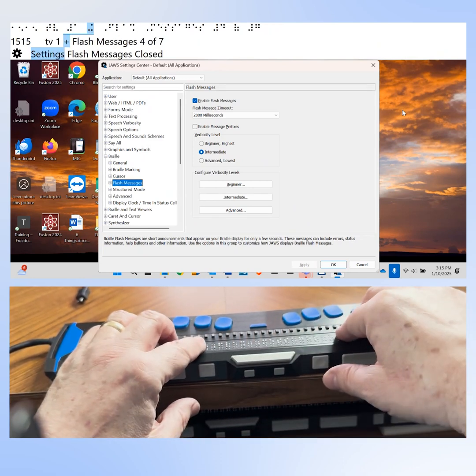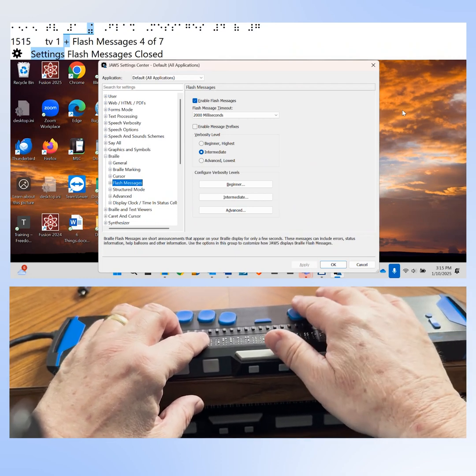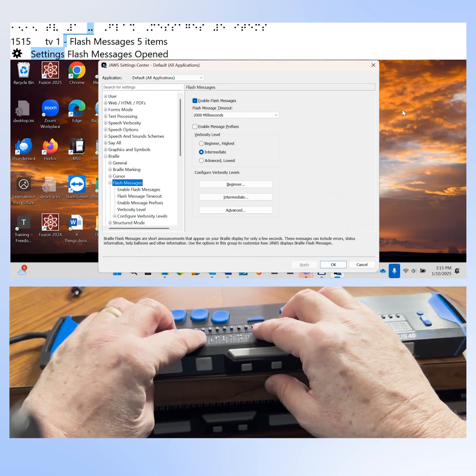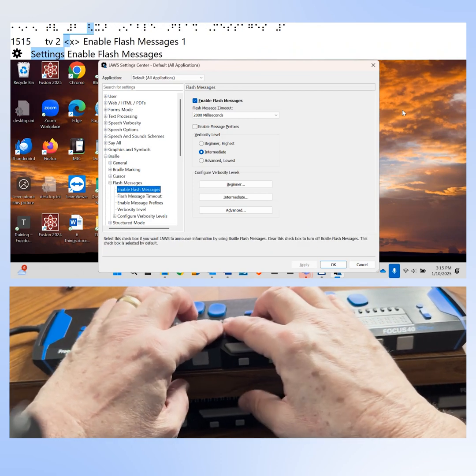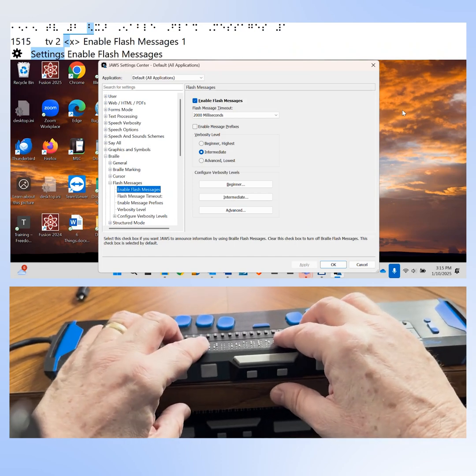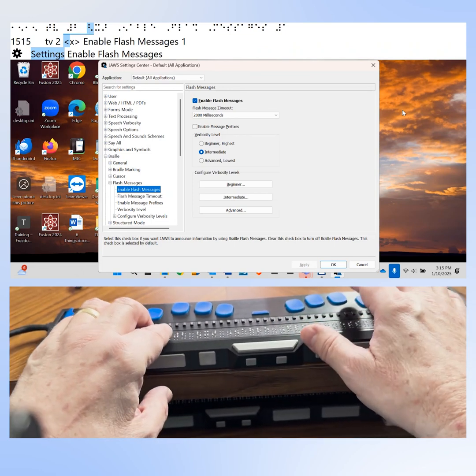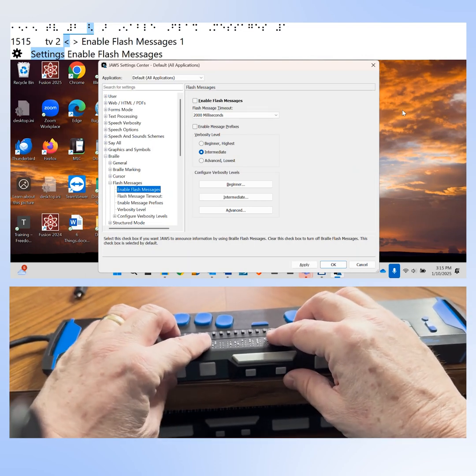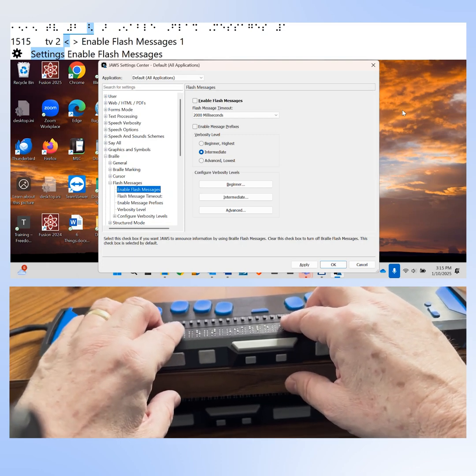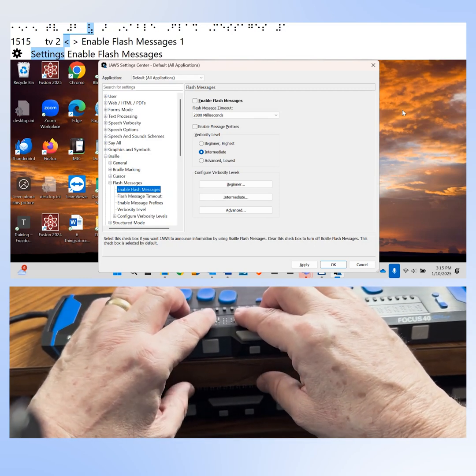The Flash Messages branch is closed — four of seven under Braille. Press right arrow to open it, showing five items. Press down arrow to reach "Enable flash messages," which is currently checked. This checkbox lets you enable or disable flash messages. I have flash messages enabled so the checkbox is checked. All I do is press space to uncheck it and disable flash messages. JAWS announcements and informational messages will no longer be sent to the braille display. You might find this useful if flash messages are distracting.